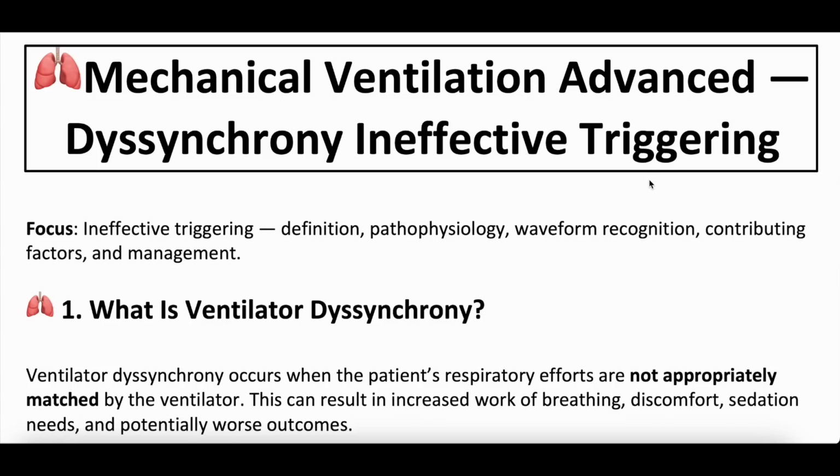We'll be talking about what ineffective triggering is, what causes it, waveform analysis, how to approach it, how to fix it, all that good stuff.